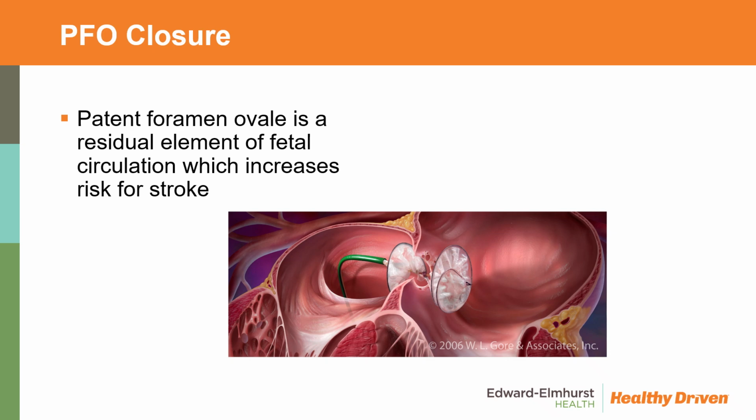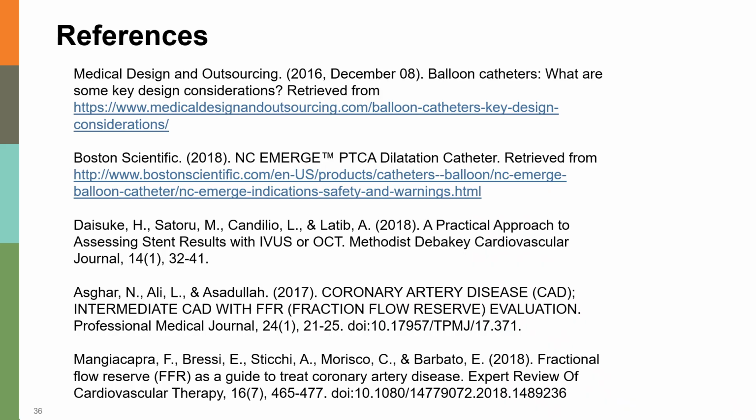Our PFO closures. Patent foramen ovale is a residual element of fetal circulation, which increases your risk for stroke. So we'll go in and put in one of these occluder devices we can see here.